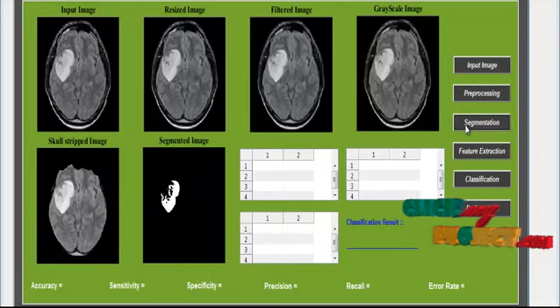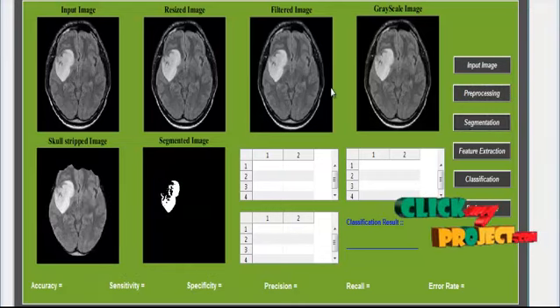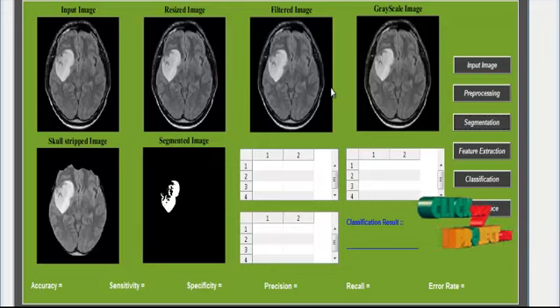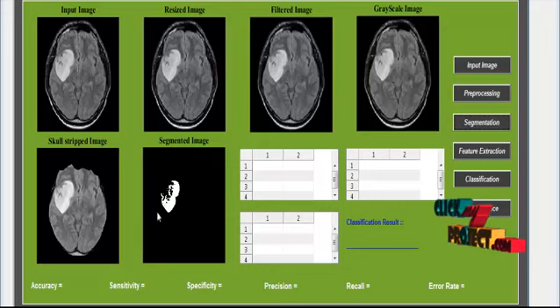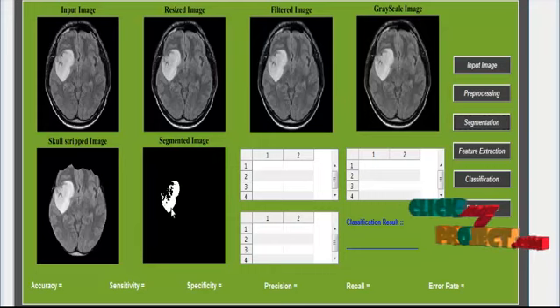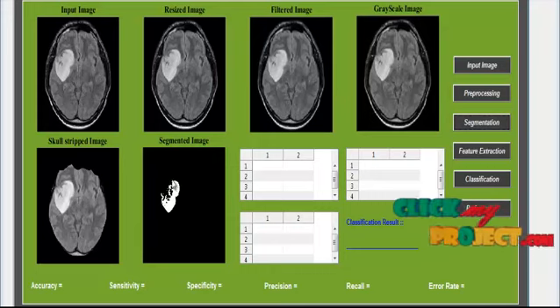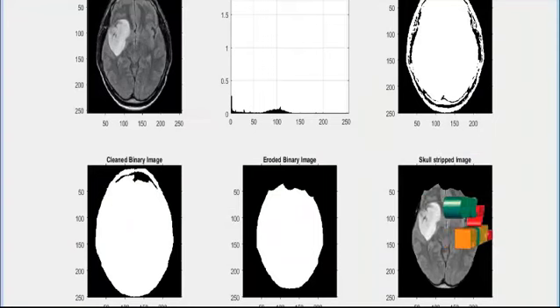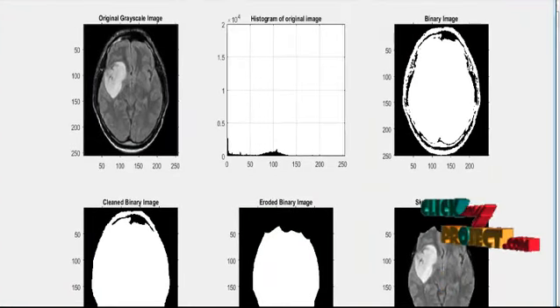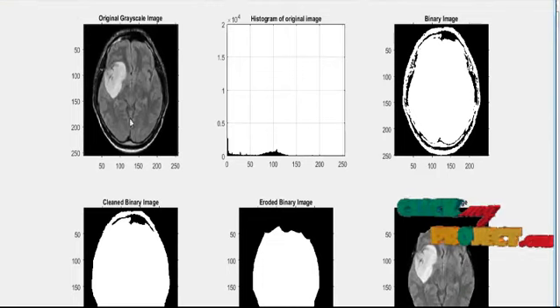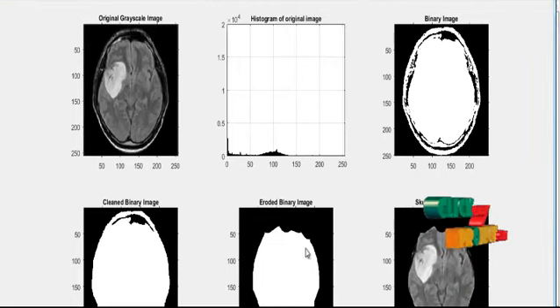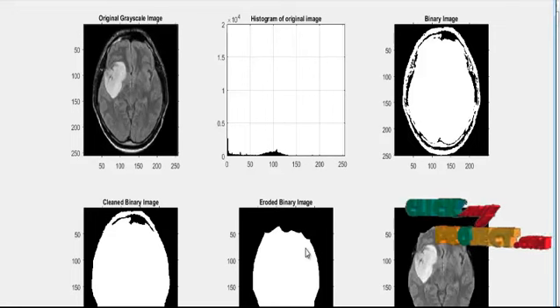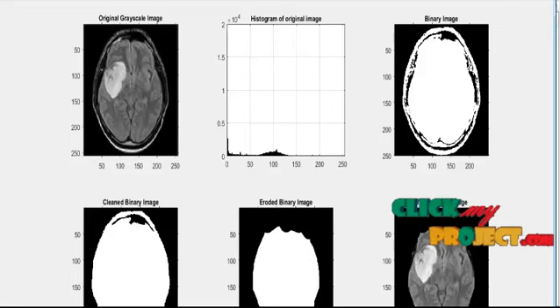In segmentation, first the skull is stripped from the image, and then the final tumor portion is extracted. In between, some intermediate results are visible, such as the original image, binary image, and the eroded image, which represents the skull region of the brain being eroded.